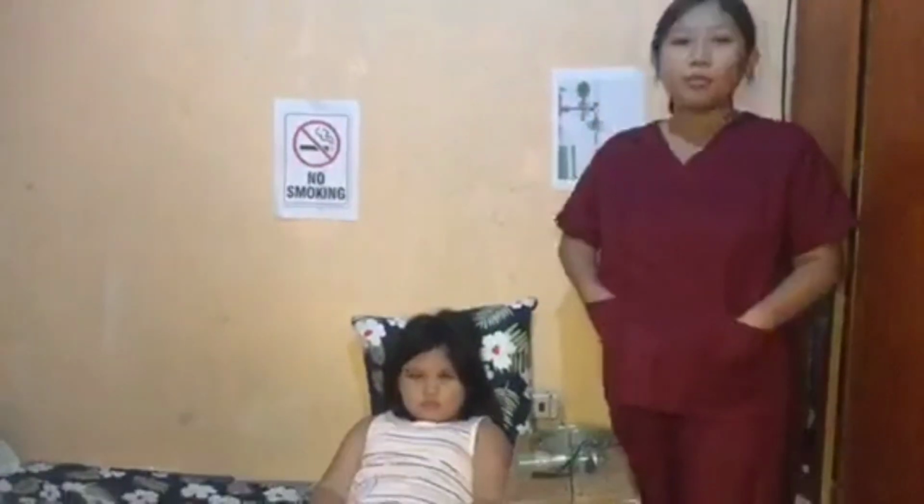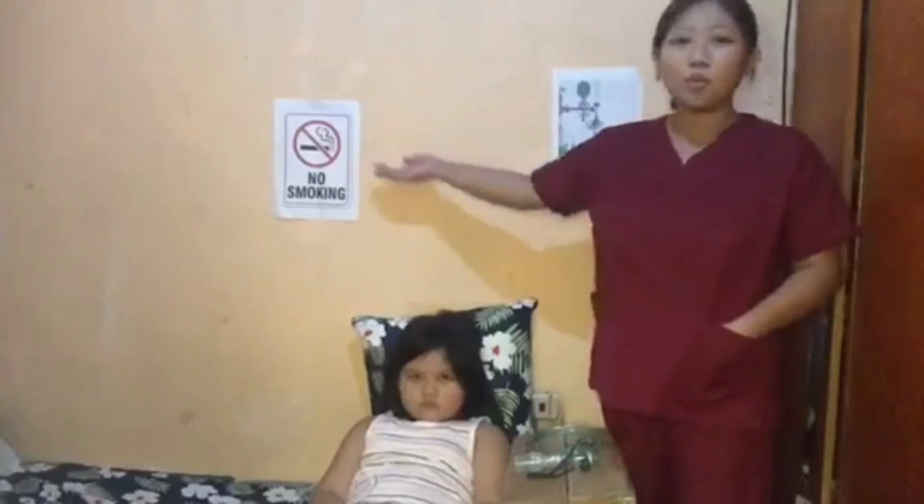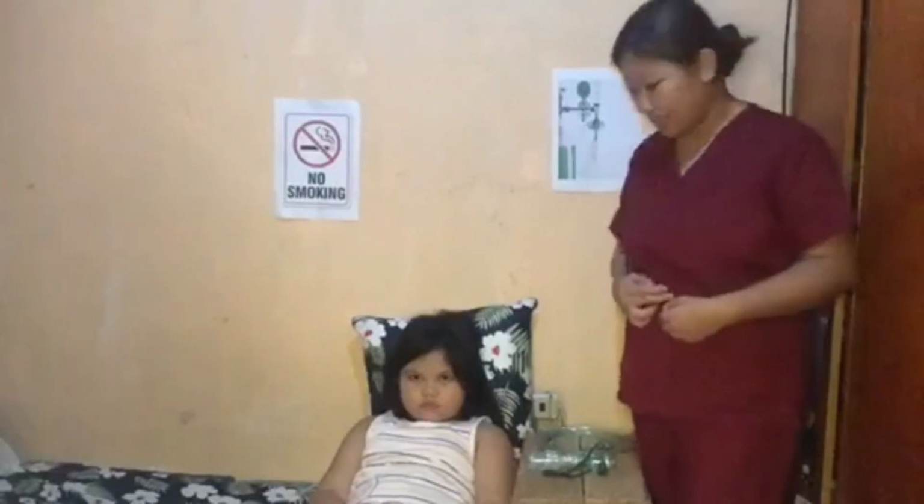Okay. Provide privacy by closing the doors or drawing the curtains. Review safety precautions necessary when oxygen is in use. Place a no-smoking sign in the appropriate area. The next step is to attach the face mask to the oxygen source with humidification if appropriate for the specific mask.